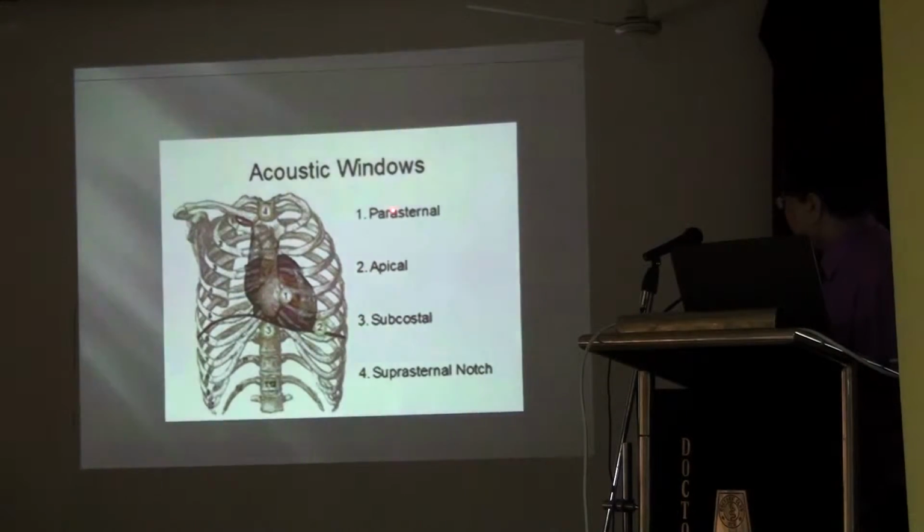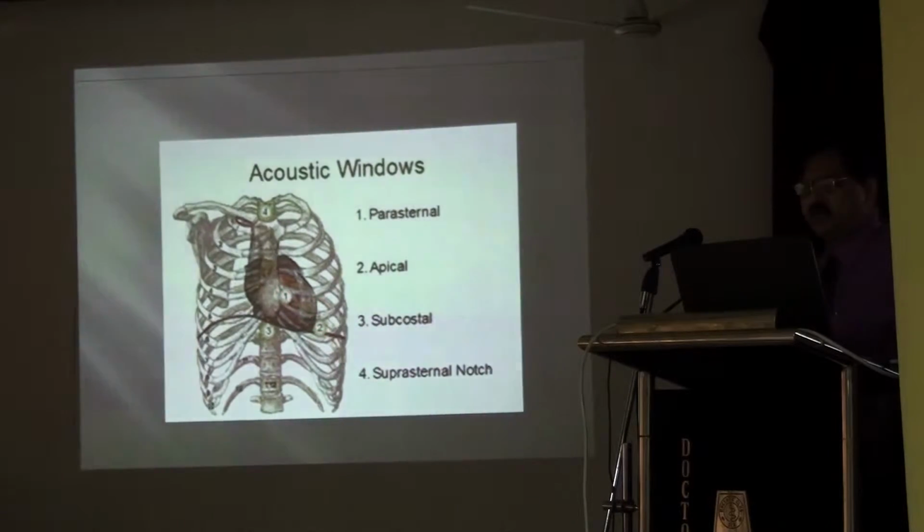This is the parasternal, apical, subcostal view. So parasternal view we started, go to the apical, look for 4 chamber, 2 chamber, 5 chamber. These two generally I used to finish because we have to do 20 echoes per day approximately.